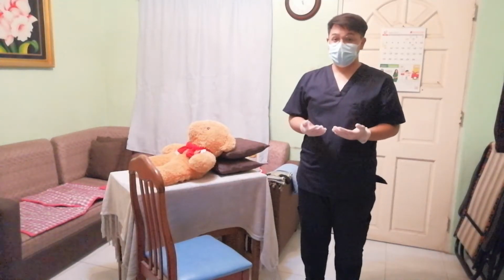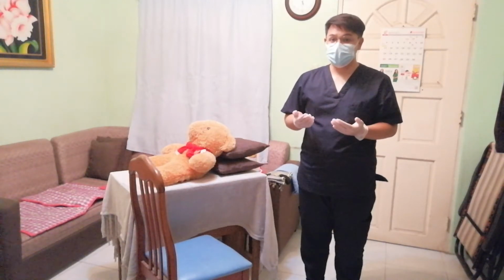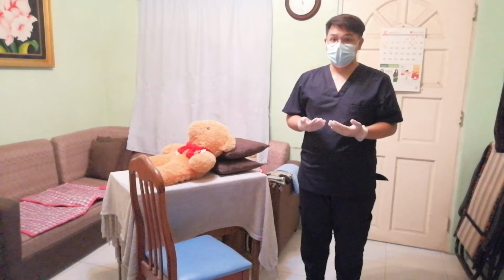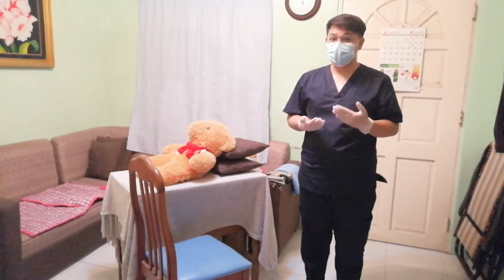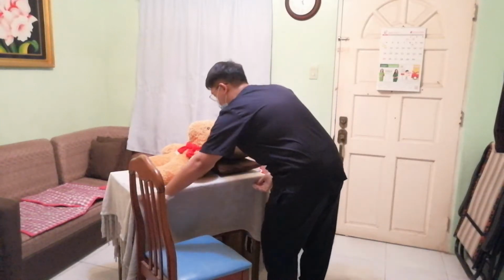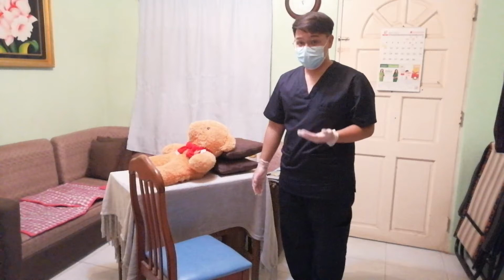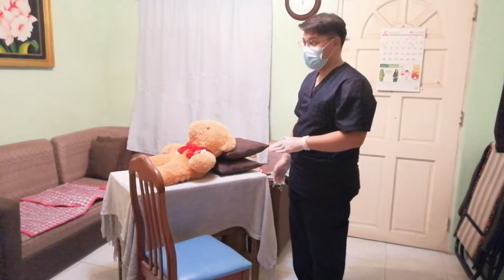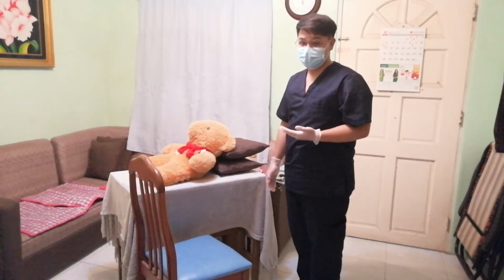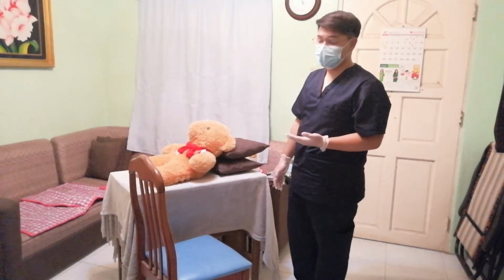And for our fifth step, we need to lower the bed to the lowest position, and raise the head of the bed to a sitting position or as high as the patient can tolerate. So for example, I have already adjusted the bed to the lowest position, and let us assume that I have already placed the head of the bed in a sitting position.